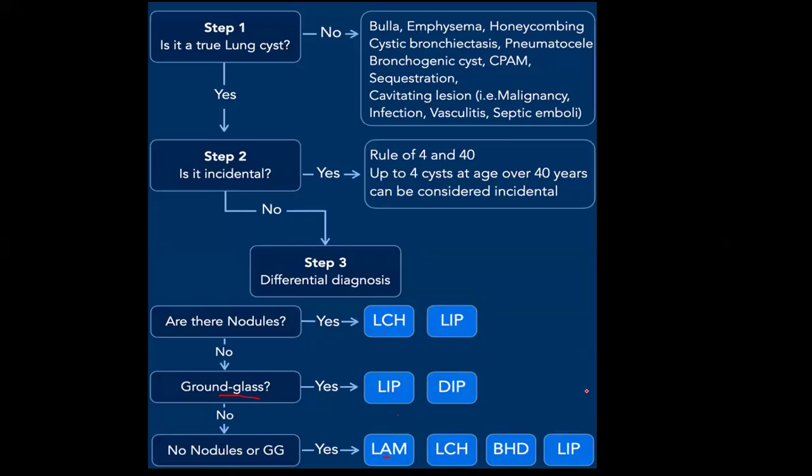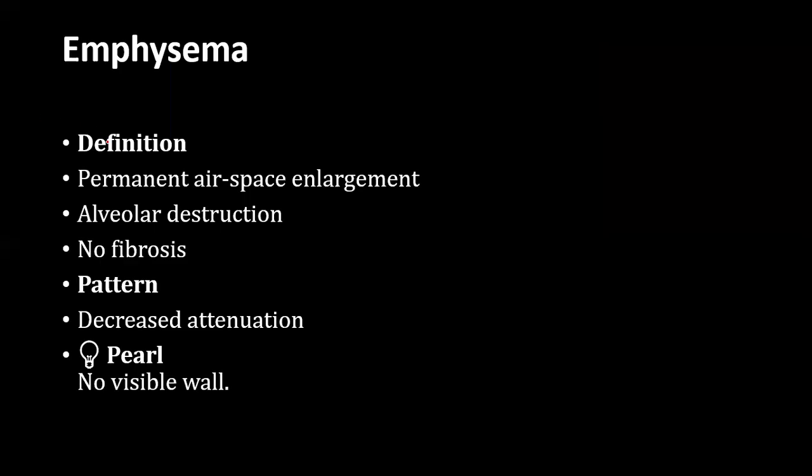Please take a screenshot. It will be very helpful. I took most of the images from an article. I'll be sharing the link of the article if you want to know. It's a Radiology Assistant article. You can go through the article. It's very helpful. Whenever you come across an HRCT, open up that article and go to that disease. It basically gives most of your answers, right?